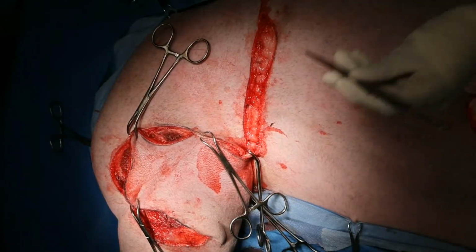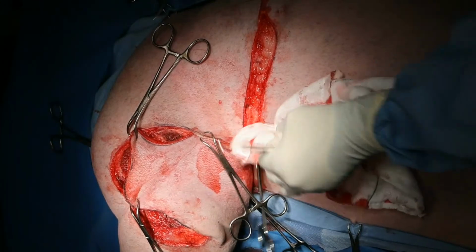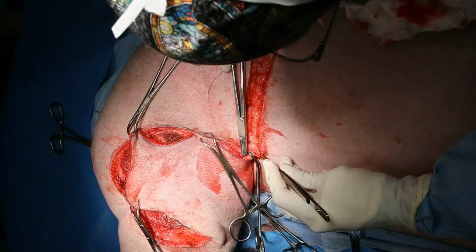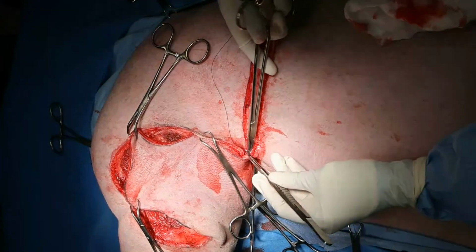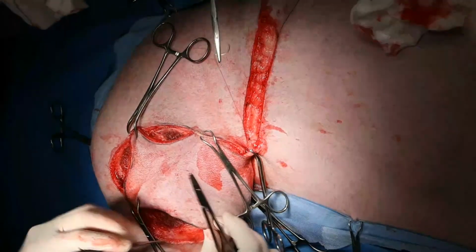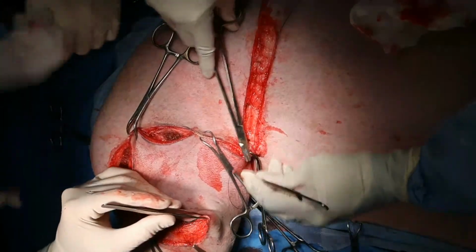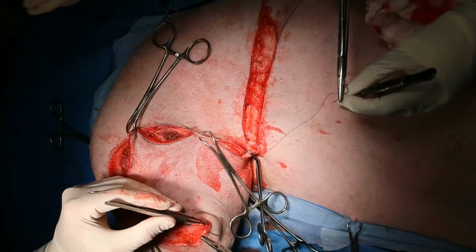You're probably okay there. Can I get another 2-0, please? Just tell me if you need me. No, you're fine. I'll just try my best. Sonia will just elbow you. Feel free. All right, so now I'm just going to do a sub-Q layer here.